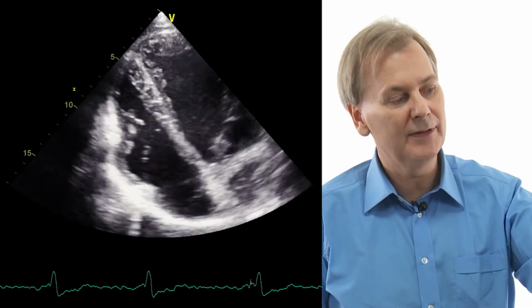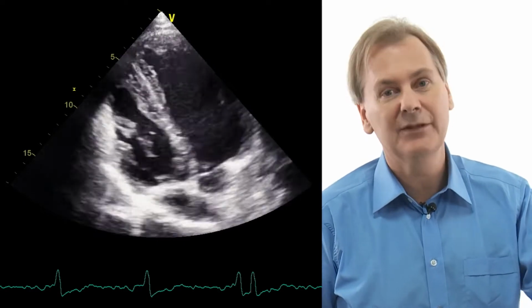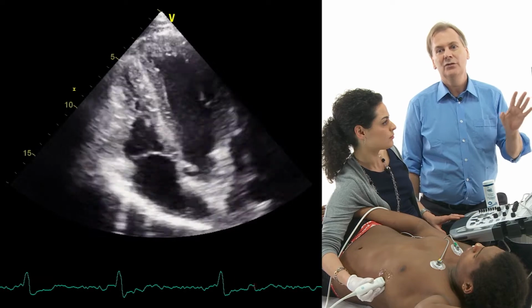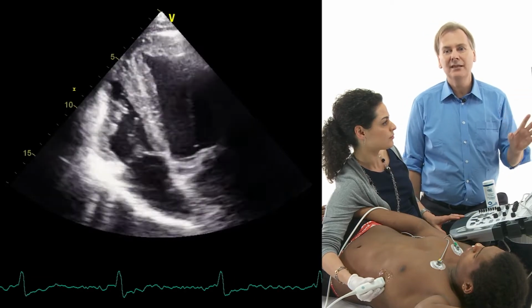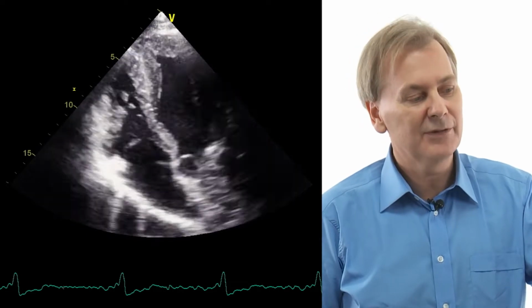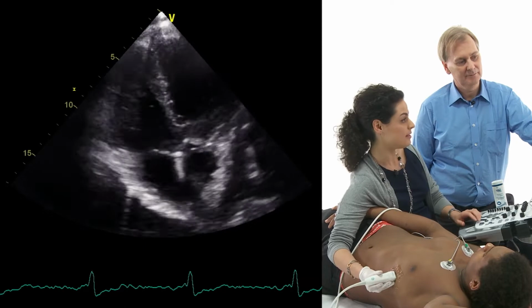So now you're more perpendicular, which gives you more echoes and which allows you to see the right ventricle much, much better. Now, in him, we get good image quality even in a normal 4-chamber view. But in many individuals, with this slanted view that Anna is showing you right now, you would get a much, much better view. Yes, Thomas, and when we want to measure the ventricle, it's extremely simple.